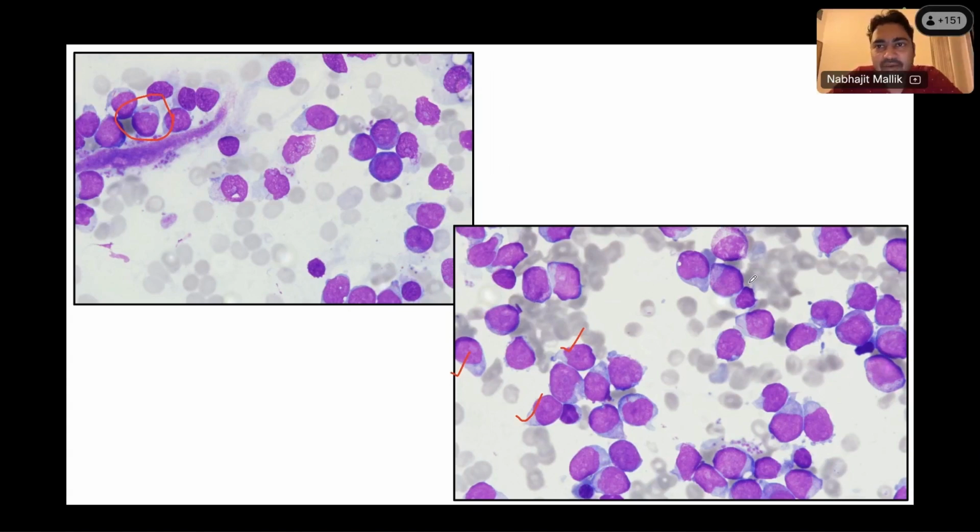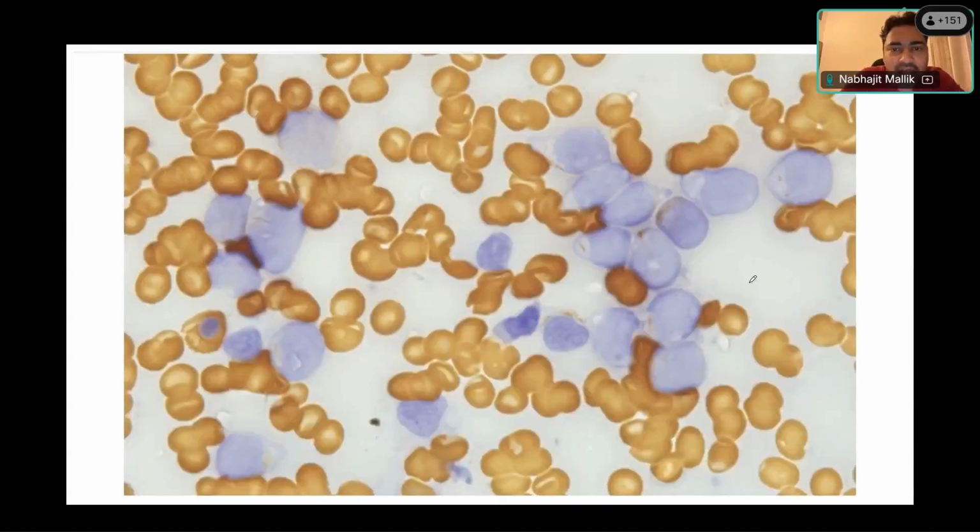Or Ekta, anybody? So the monocytic leukemias or the erythroid leukemias or the megakaryocytic leukemias, right? These are all kinds of acute myeloid leukemias which can be MPO negative as well, right? So MPO is a very good stain to say whether it is an AML or not, but it can be negative. So I think I've given you an MPO stain here.